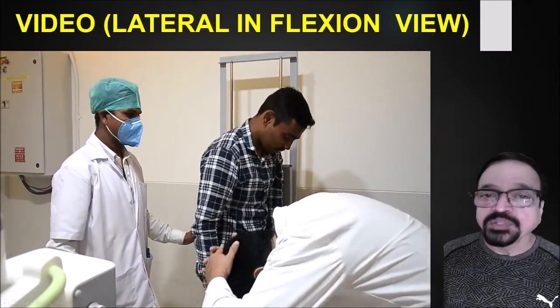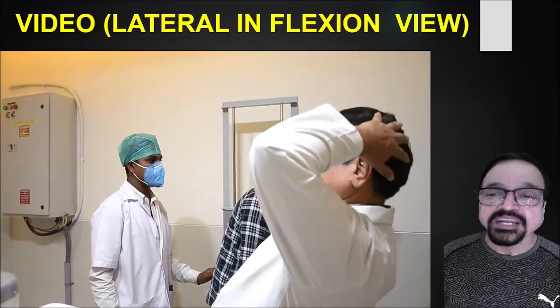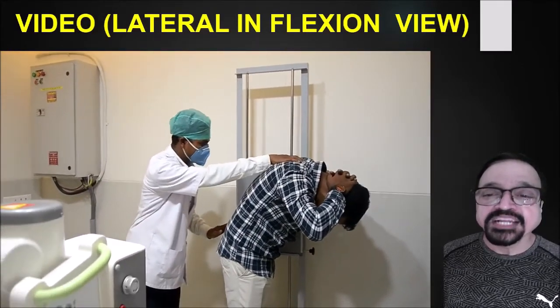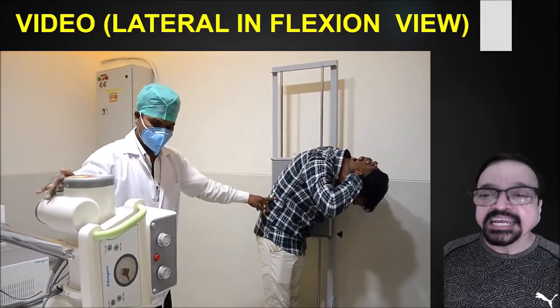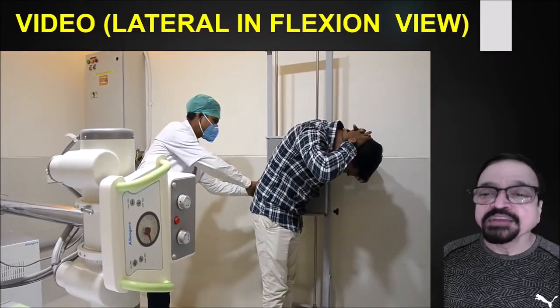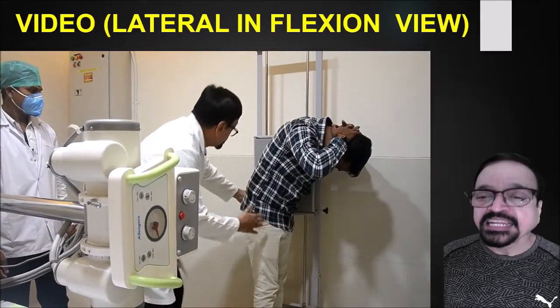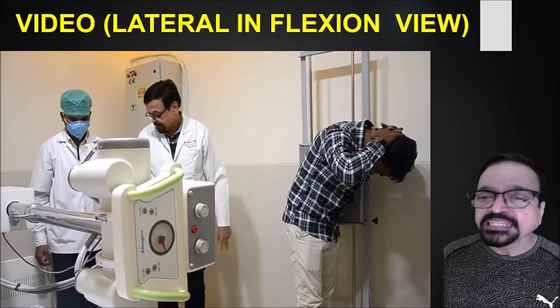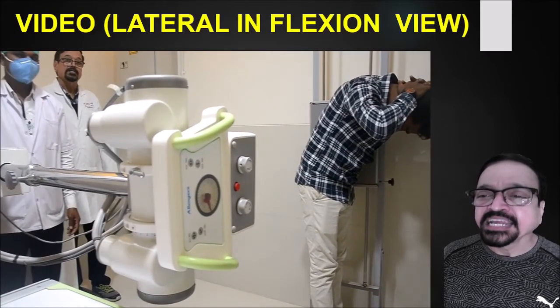Now see, this is how the flexion is done. That is to see the movement. This is extension now. So we have to go for a neutral, flexion and extension. Here sometimes you will have to use a horizontal cassette, number one, if the patient is not fitting in a single cassette, number two, if the area of interest is larger. Now here the cassette is adjusted, again L4, L3 is the center. A perfect true lateral is essential. So also centering at L3 level is mandatory when you are taking these X-rays.